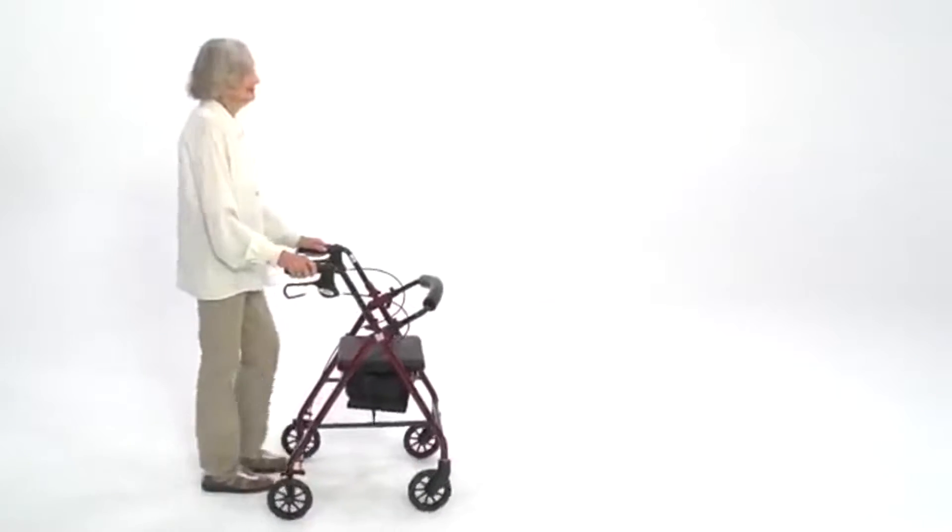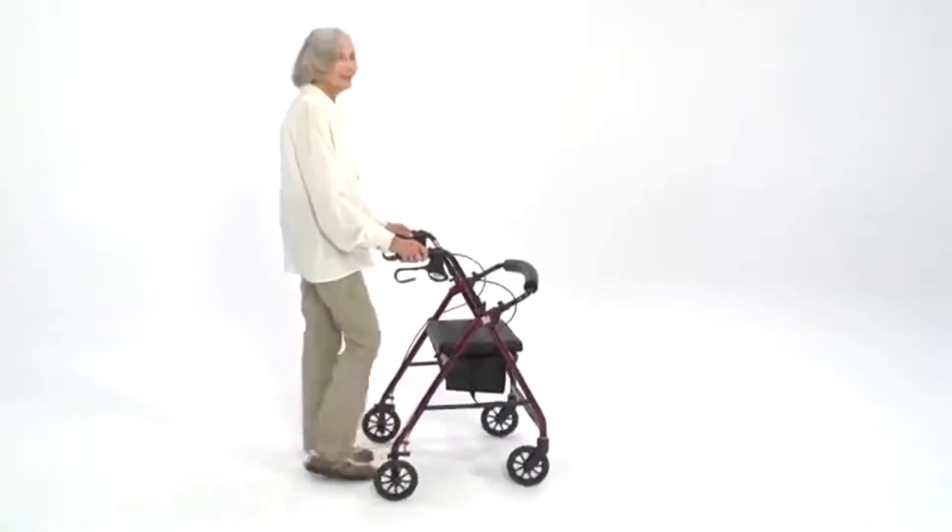Even though this folding rollator weighs only 12 pounds, it safely supports up to 300 pounds.